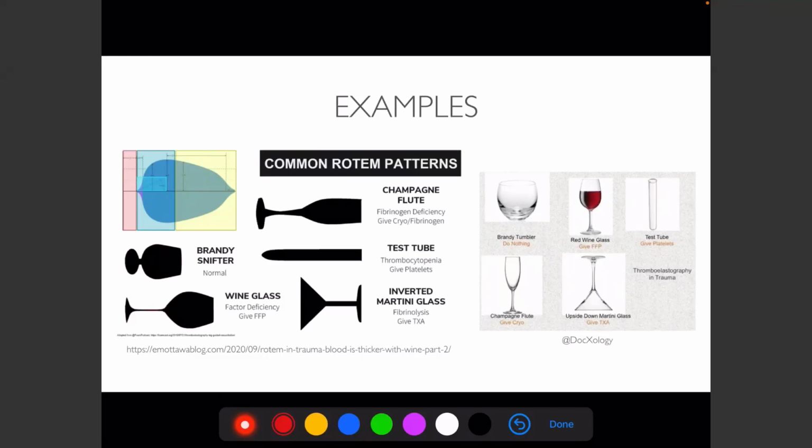And that's the level of trauma center. So to that point, before you keep going, you think that it'll become more commonplace to utilize things like Rotem? Anything that helps get product sparing going on, or at least shows that it's safe to be product sparing, is probably going to be where it's at. And I think to that point, you might not see a lot of large randomized control trials. With a lot of technology, there's enough out there, you'll see it quickly adopted for that use.